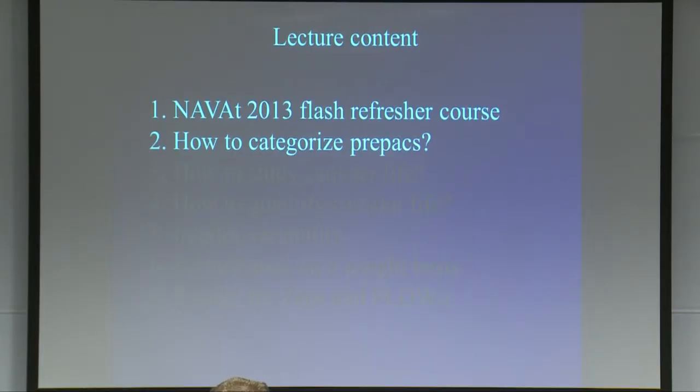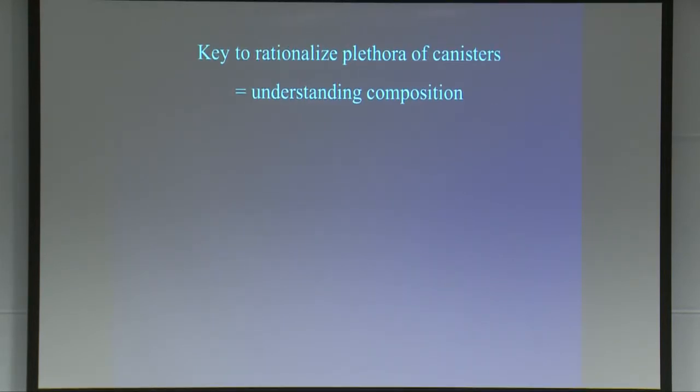So I'm going to present the results of more than 200 measurements over the last 2 to 3 years. I'm going to start by making sense out of these pre-packs. I want to mention that I only tested pre-packed canisters, the reason being that I have an interest in automated low-flow anesthesia. Pre-packs there are very convenient. They keep the volume small. It's easy. You don't have leaks when you replace them. So I'm only going to talk now about pre-packs.